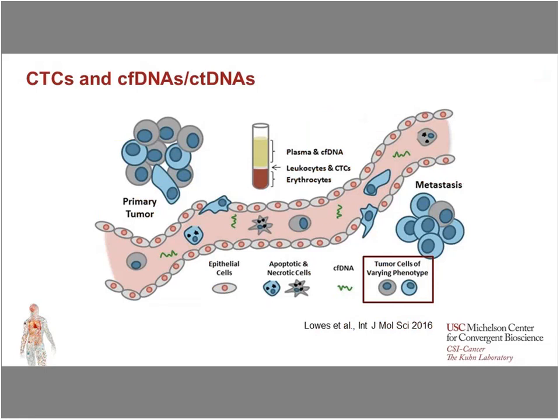These cells circulate in blood with varying phenotypes, which is highlighted in the red box on the right bottom corner. Compared with cfDNA, which is highly fragmented, shortened DNA fragments, the intact circulating tumor cell contains more information, which makes extensive downstream analysis like morphology, proteome, and genome possible.